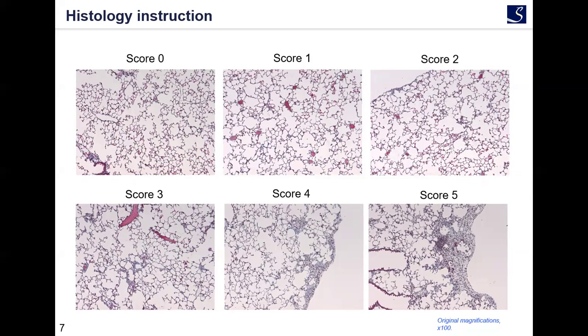Histological staining of each stages looks like the picture shown here. Score 0 is normal lung. Score 1 shows minimal fibrous thickening of alveolar or bronchiolar walls. Score 3 is moderate thickening of walls without obvious damage to lung architecture. Score 5 is increased fibrosis with definite damage to lung structure and formation of fibrosis band, or small fibrous masses. Score 7 is distortion of structure and large fibrous areas. Score 8 is total obliteration of the lungs. Score 2, 4, 6 is in between stages.